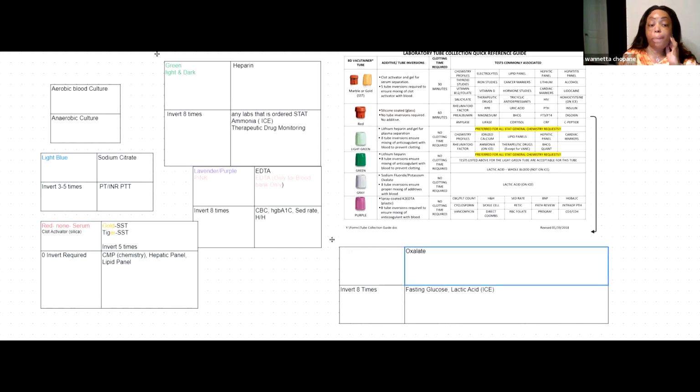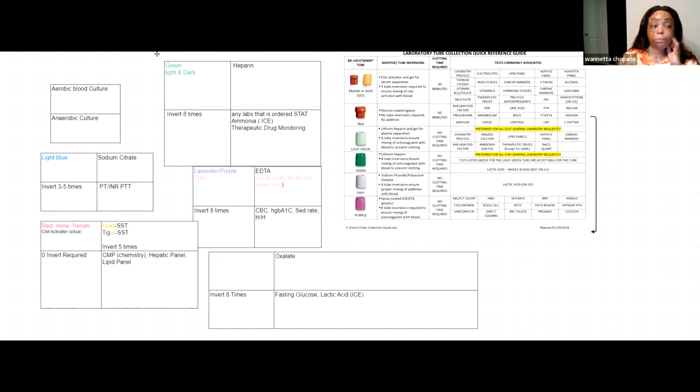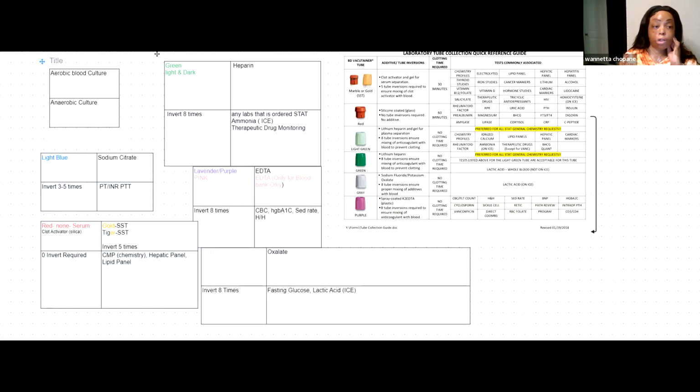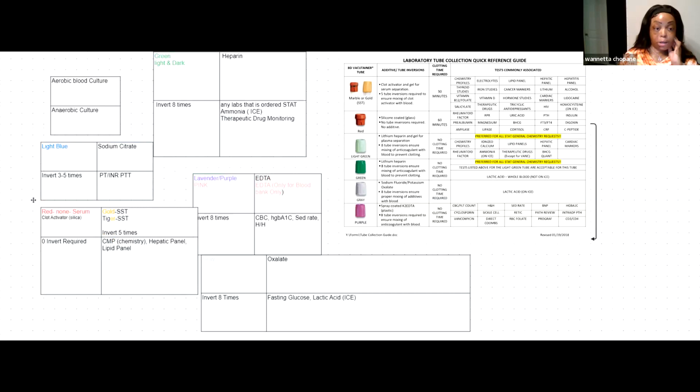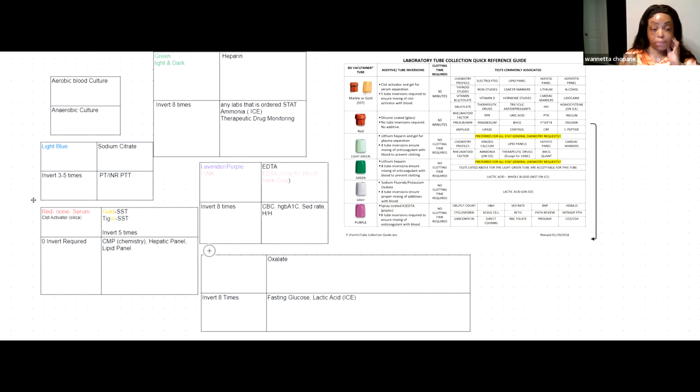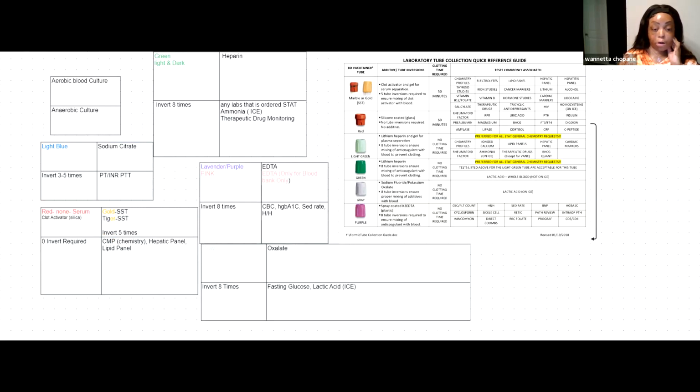I also have little boxes here, because for me, I feel like that's what the order of draw is kind of separated in. Give me 1 minute, because I want to make sure you all can kind of see, because it depends on what screen you're looking at, phone, tablet, computer. All right, so with this being said, we do have our order of draw.